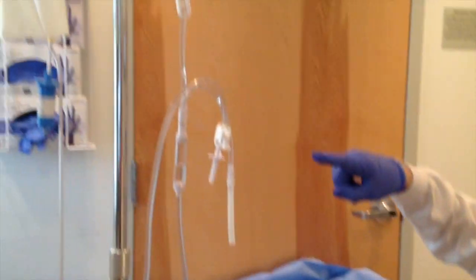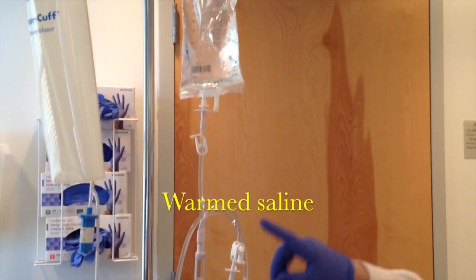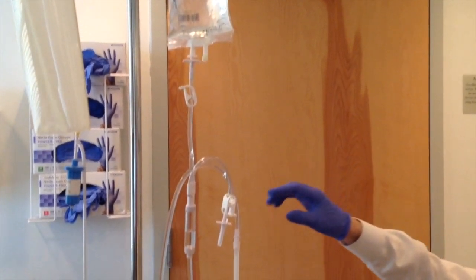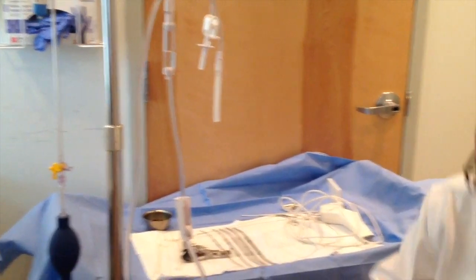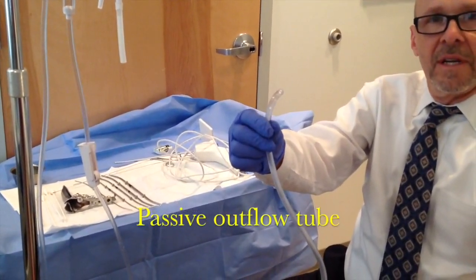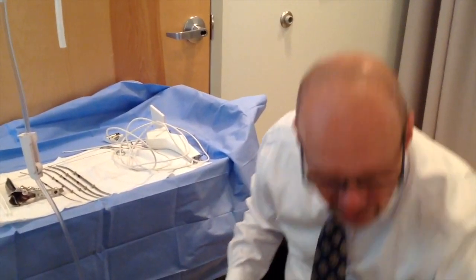We've got an IV bag with saline and IV tubing. You can do it under pressure, but we found we don't have to. All you need is the inflow, and then we'll use this as an outflow to gravity. We usually put it in a can with the outflow in a plastic bag.